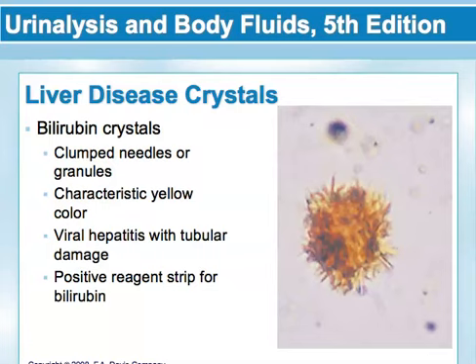of the crystals. Viral hepatitis or other disorders that produce renal tubular damage can produce crystals that are incorporated into the matrix of casts.